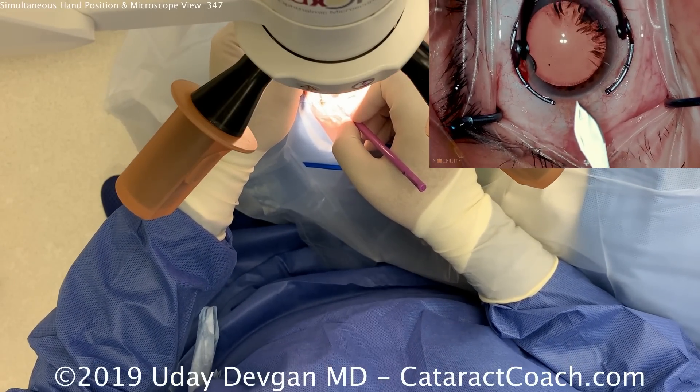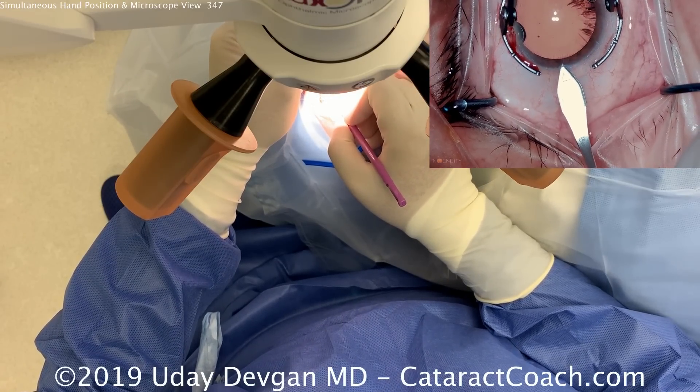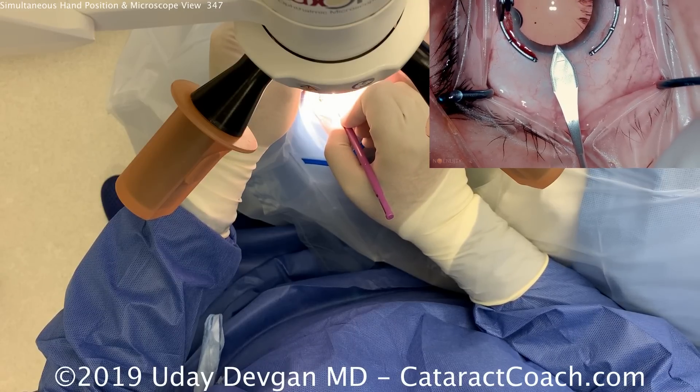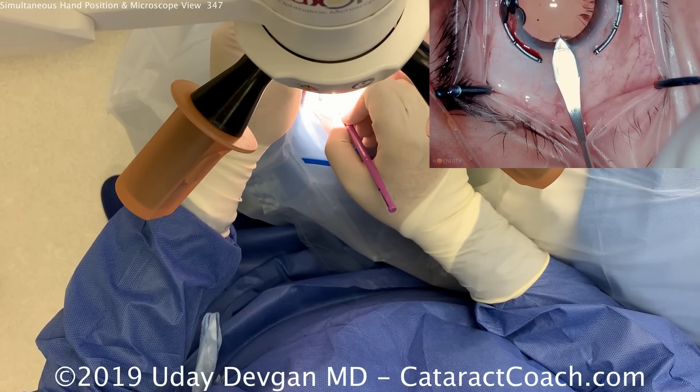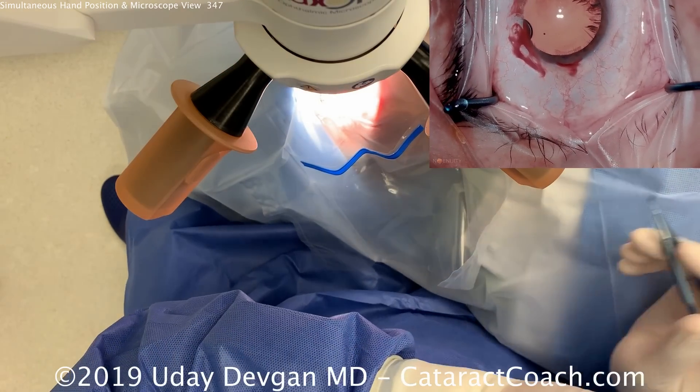The right hand now has the keratome, and we position that to make our main incision. The right hand is holding the keratome like a pencil — that's the most precision, the best control during surgery.